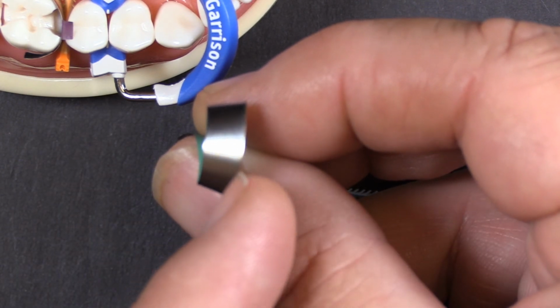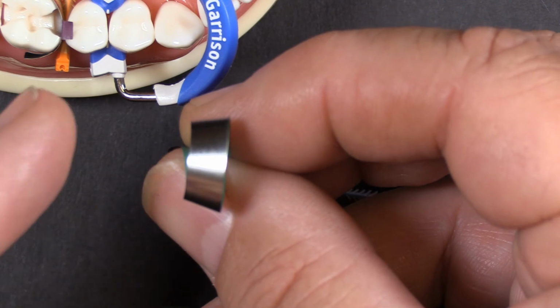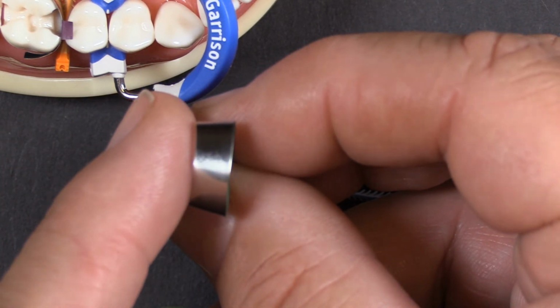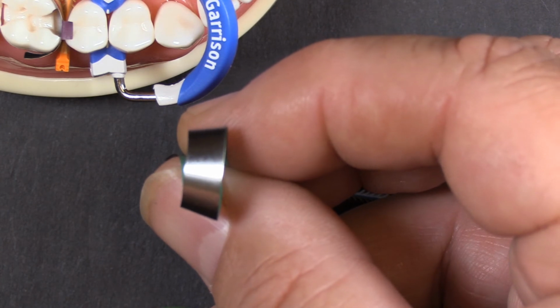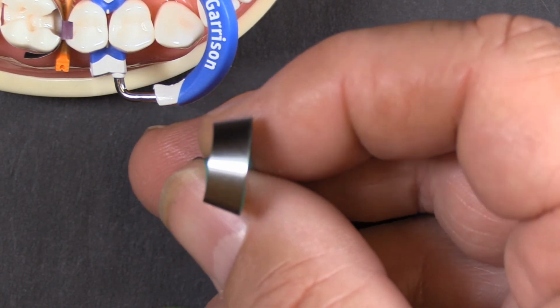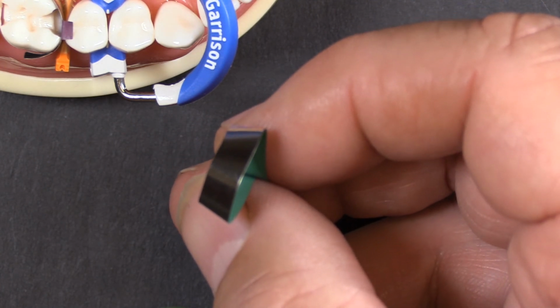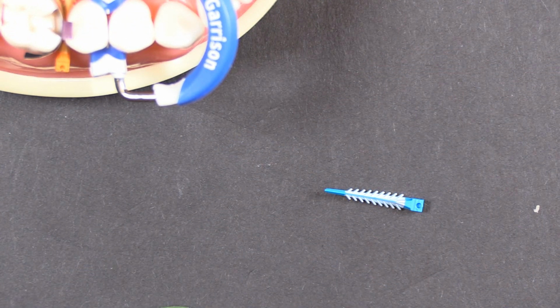The upper portion of this band reaches, the gingival is tight up against the tooth, and this upper portion reaches over to that adjacent tooth more readily. So you might try a band like this. It's called a right curve Tofflemire band if you're dealing with a very pronounced gap that you're trying to close.